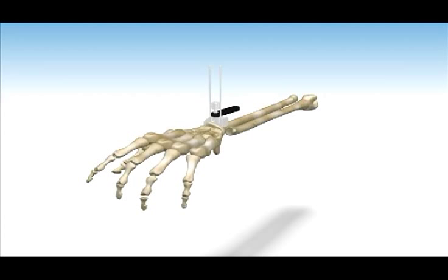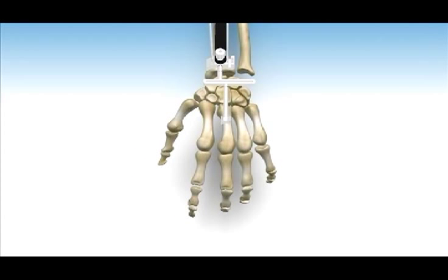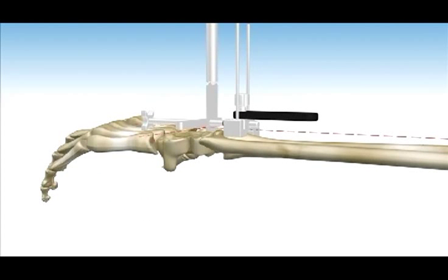Step 2. Insert the PGT carpal cutting guide into the PGT guide and tighten in place. The position of the carpal cutting guide should be established based upon a preoperative assessment using an X-ray template. Place the carpal cutting guide across the wrist and align with the third metacarpal. Typically, the lunate, triquetrum, proximal scaphoid, and head of the capitate are resected. If the carpal cutting guide is placed correctly, the cut should be perpendicular to the long axis of the forearm. Resect the carpal bones with an oscillating saw. Remove the carpal cutting guide from the PGT guide.